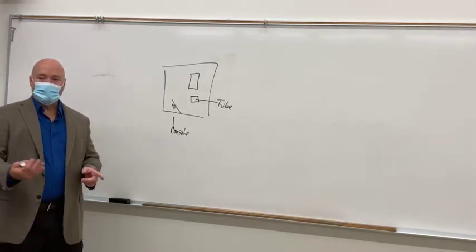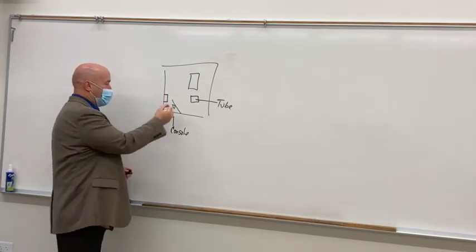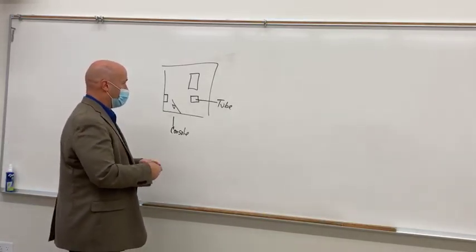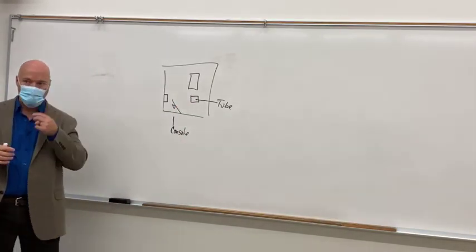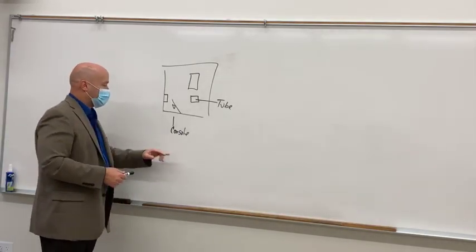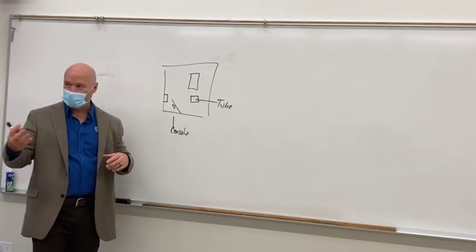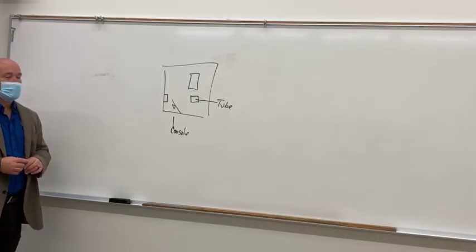That thing could be almost anywhere. In some of your rooms, it's going to be in the room itself, sometimes halfway behind the control panel. Sometimes it'll be up in a false ceiling. Some of your systems are built so that it may be actually inside the tower itself, okay? So the difference between those three things is the console is where you control everything, the tube is where you make the exposures, and the high voltage generator system is what creates that high voltage, okay?